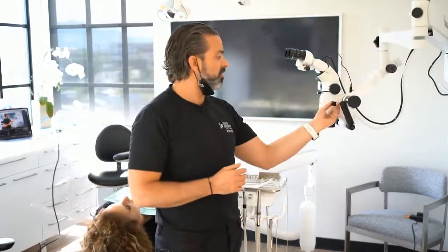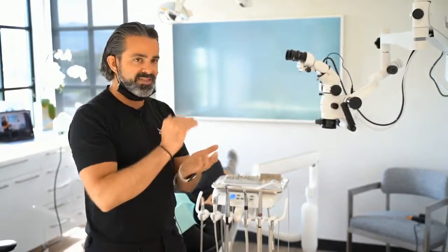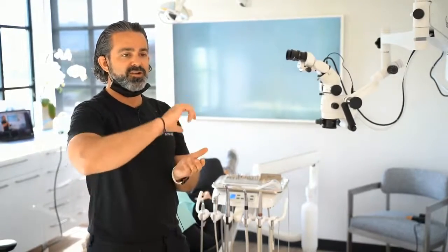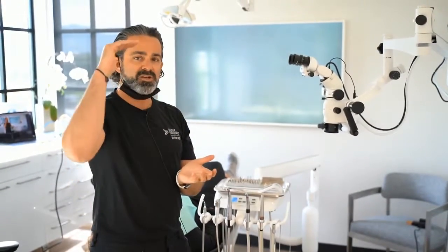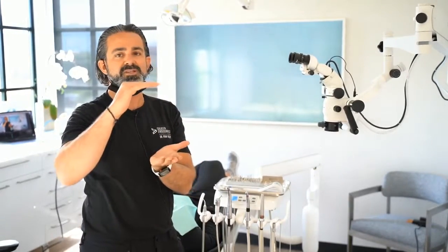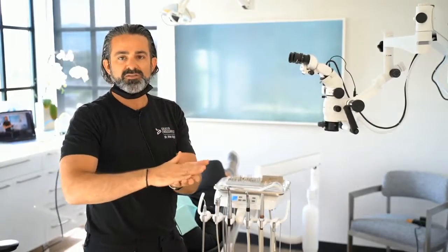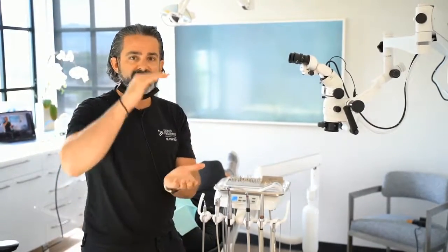With the 6, when they do the steps, it's the incremental changes between the magnification factors, the more subtle, less of a jump, that is why you like that, because as I go up in magnification, my depth of field goes down. So if I'm up at a 5, it's hard to actually focus on the occlusal surface and the pulpal floor. That 5-6 millimeter difference isn't all in focus, which doesn't matter if I'm only looking at the floor. But if I need to see the depth, then I'm backing off to like a 3.